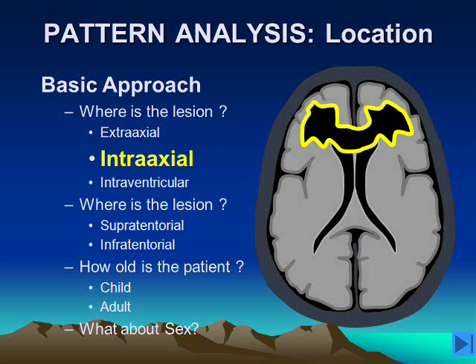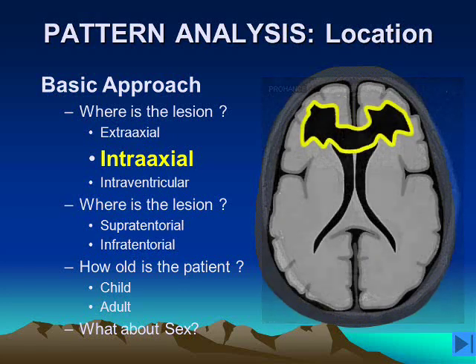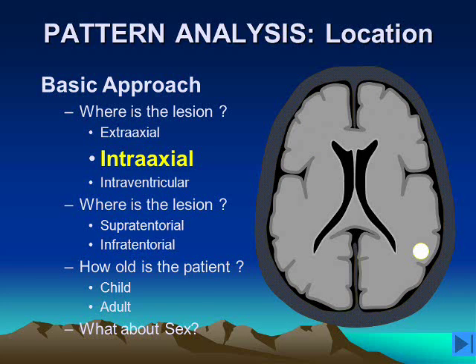A lesion in the corpus callosum has a very limited differential diagnosis. One possibility would be primary central nervous system lymphoma, as is seen here in this patient on the axial T1-weighted image post-gadolinium. Intra-axial lesions may also be nodular lesions just below the cortex, which is typical for hematogenous metastatic disease. Patients with hematogenous dissemination may have multiple lesions in a similar subcortical location just below the gray matter.